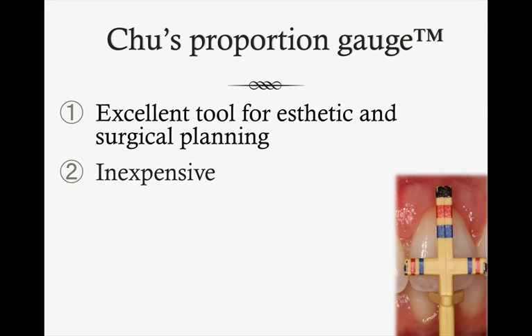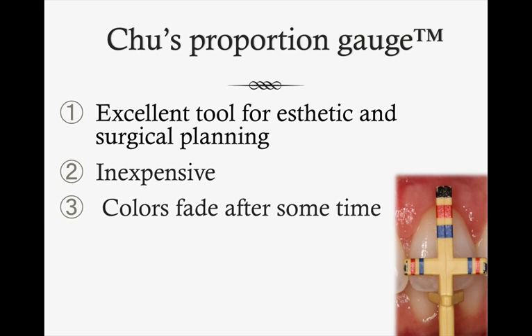It's very inexpensive, certainly worth having in your practice as one of your tools. Just be aware that the colors on the gauge fade over time, and it's usually not a big problem. But if they fade too much, you may want to just replenish and get a new tool. That's really the only criticism I have of the tool. But it's certainly excellent, and I do recommend getting it.